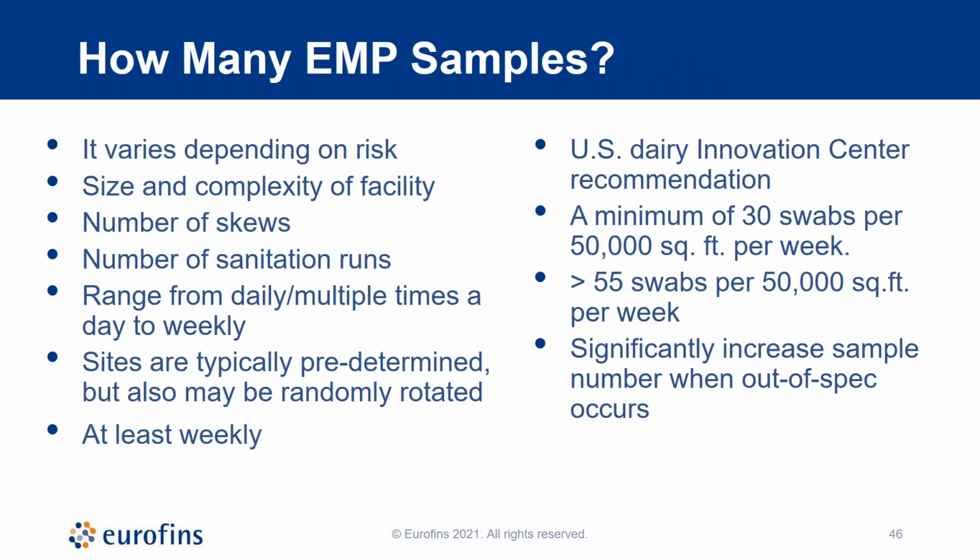How many environmental monitoring samples should you take? Again, depends on what your appetite for risk is, but if you really want to protect your brand, then taking a handful of samples once a week may or may not be a sufficient number of samples to take at a sufficient frequency to legitimately protect your brand. So I can give you maybe some examples.